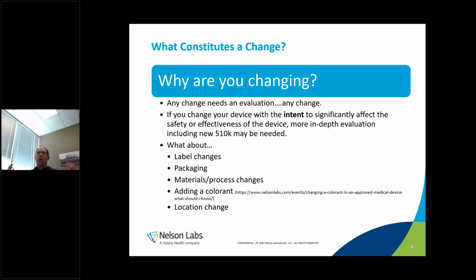So here are some of those things that we see routinely. Every day we do biological evaluation plans, we do gap analysis, we do failure investigations. My team is involved every day in these things. One of those things we do almost all the time, every day we get calls in for this, is changes. We see it every single day where a change happens.